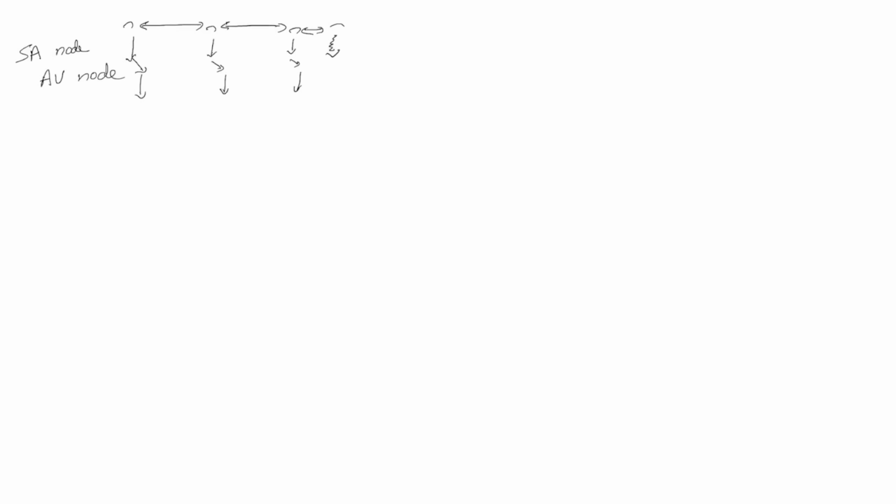Now, at this point, a few things can happen. So it can pass through the AV node and then get conducted normally to the ventricle, in which case you would have a QRS complex that looks okay. So let's say that's an okay QRS complex. The other option is it might go through the atrium but not the ventricle, in which case you would see a P wave and then nothing. And the third option, so in the first wave also you would see a P wave.